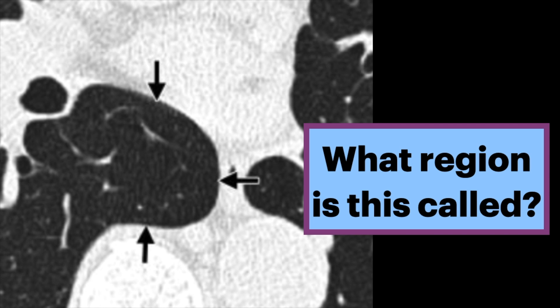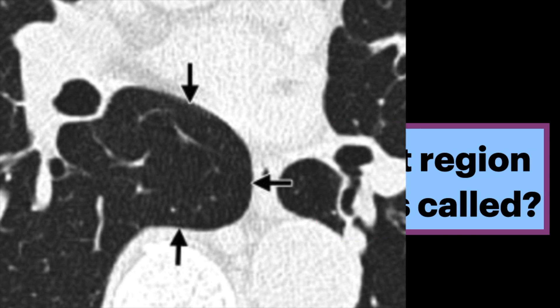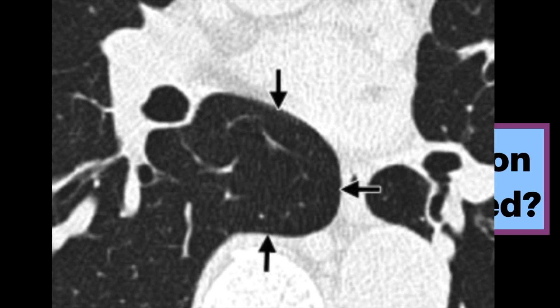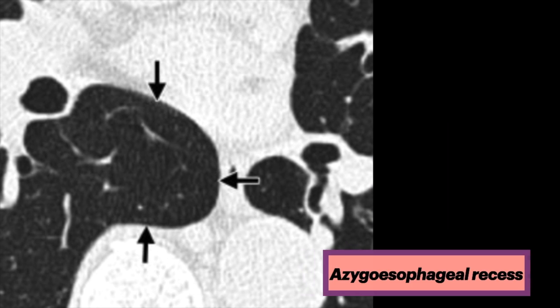What is this region called? On this axial CT, the arrows point at a region of the right lower lobe lung, which is bounded by the vertebral column, esophagus, and other mediastinal structures. This is the azagoesophageal recess.